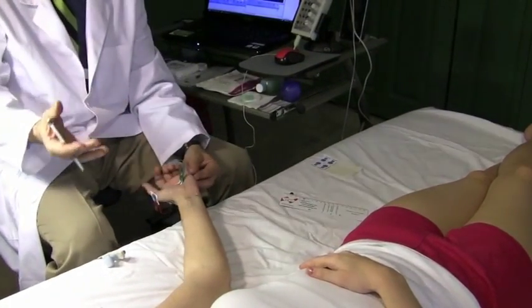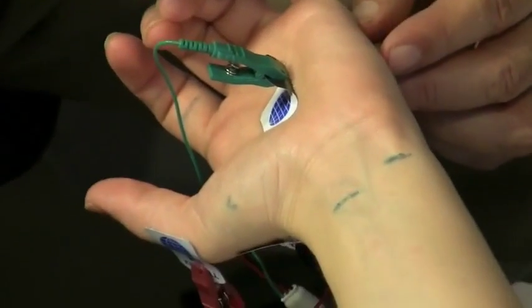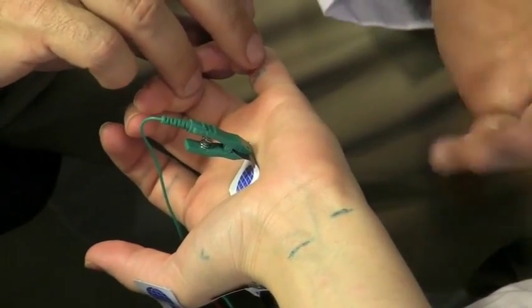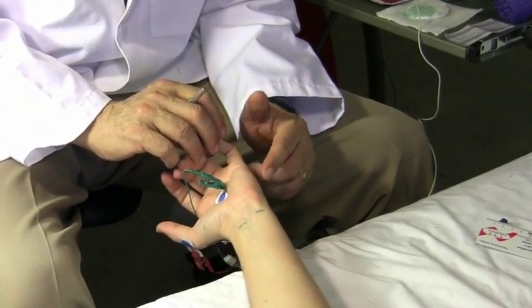Then I like to do the ulnar at the same time. And for the ulnar we record from the abductor digiti minimi muscle, and that's the muscle really here on the side of the hand. Abductor means it spreads, digiti means finger, minimi means small. So it's the muscle that spreads the small fingers.